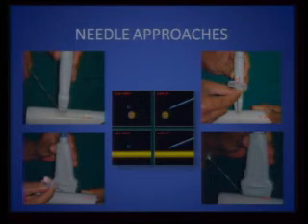So as you can see here, this is short axis. Again, this is short axis, and these two are long axis. This is short axis out of plane, short axis in plane, long axis in plane, long axis out of plane. This is self-explanatory.